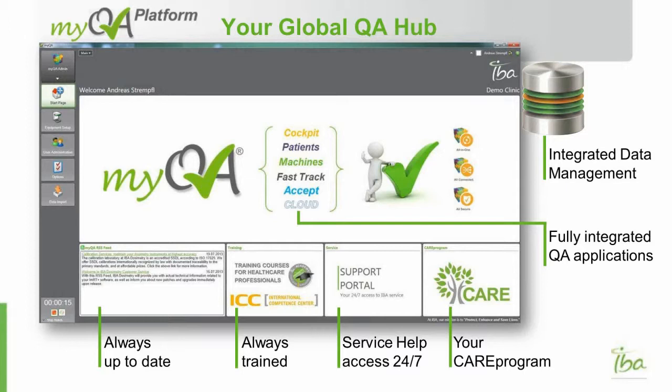involved in cancer care. There's integrated data management through a single SQL database. There's applications for each section of QA that you need to perform. We connect you with the latest information happening at IBA with an RSS feed, so you're always up to date about all the latest shows we have coming up, maybe any IBA Academy on the Road trainings or any opportunities to receive CE credits. You're always trained through any classes we have offered at our ICC in Germany. We have a support portal that connects you with IBA staff in case you have any questions or queries. And we connect you with the IBA Care program so that you can basically interact and share your experience with IBA with other users and a whole lot more.